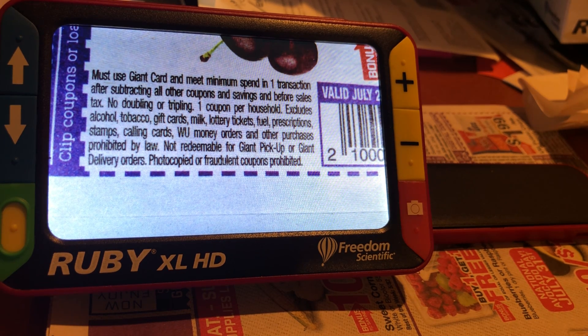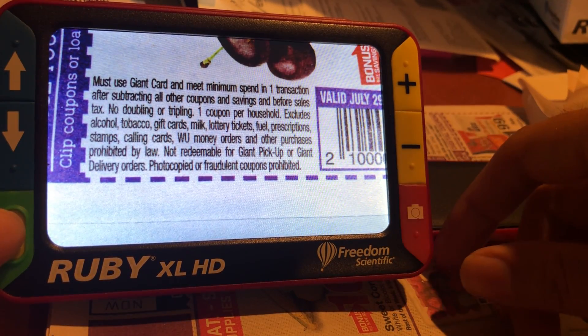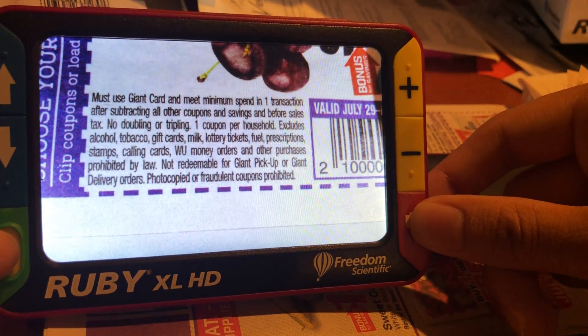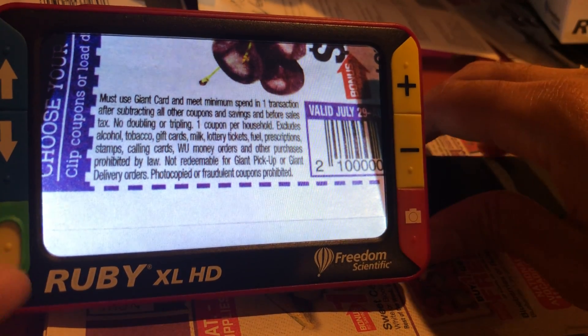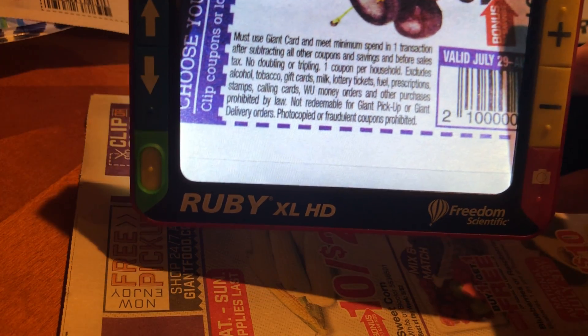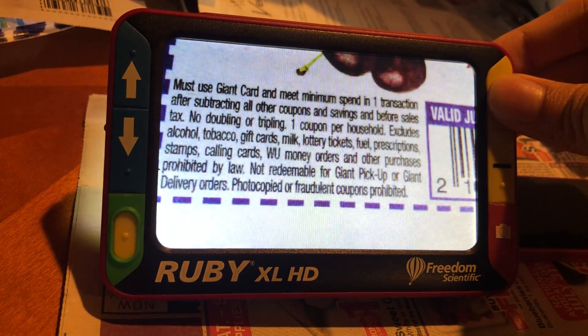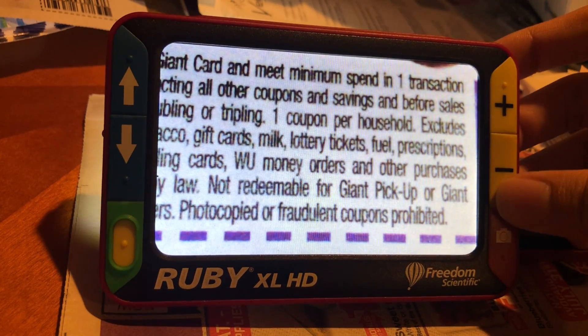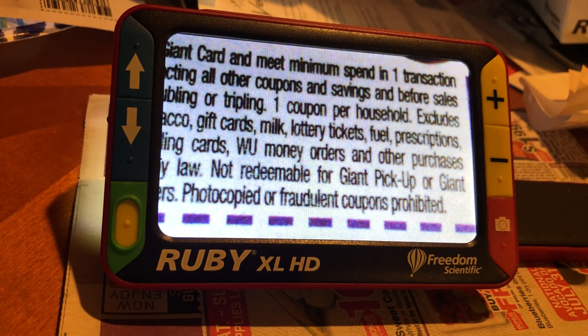Finally, you're able to take and save up to 80 screenshots, which you can save to your computer or simply keep an image on the Ruby — even if the document isn't in front of you anymore. For example, I would press the camera button on the lower right-hand side of the device to take a picture of the text on the coupon. The image is saved and it allows me to zoom in or out of the picture, and I can also save it for later.